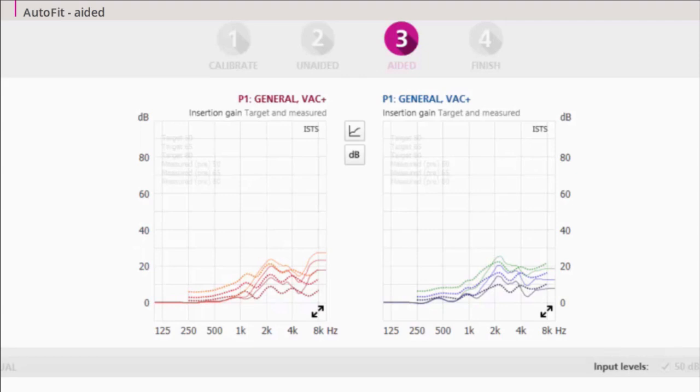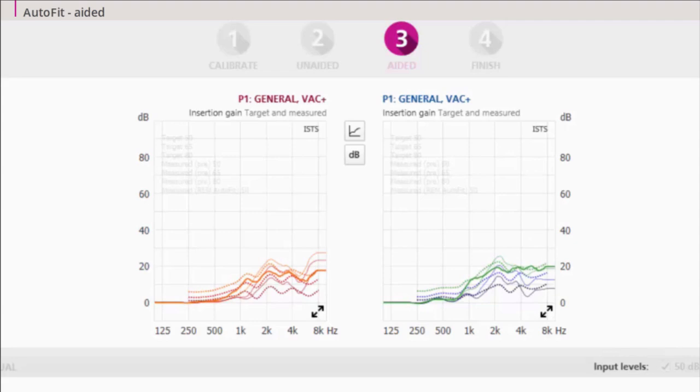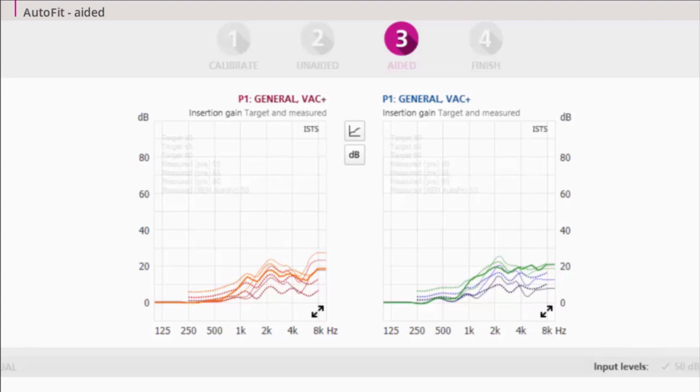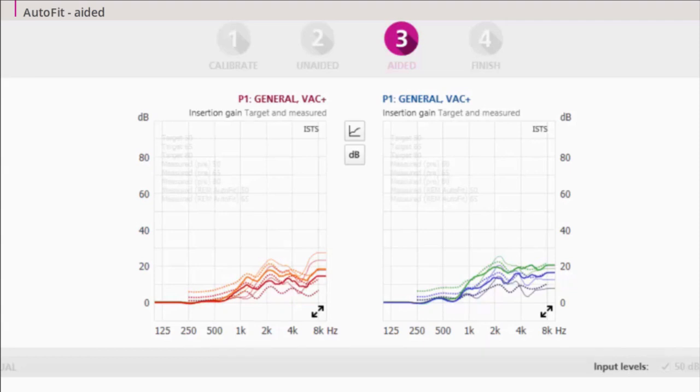The insertion gain curve is then matched to the target. The REM AutoFit system automatically changes the gain in the hearing aids to match the best possible target within the limits of the hearing aids and the selected acoustics. After changing the gain prescription, REM AutoFit runs the measurement again to verify the fitting. While AutoFit adjusts the gain, the feedback limits are applied so you can assure that no feedback will occur. The normal compression limits in GENI are applied to avoid intolerable sounds.